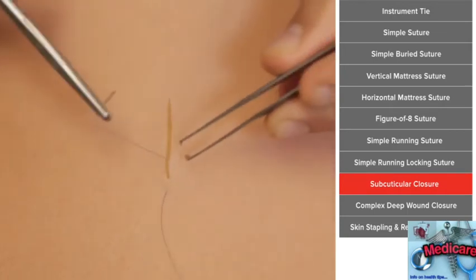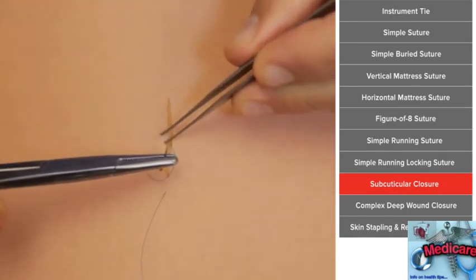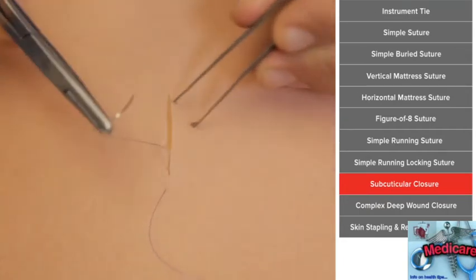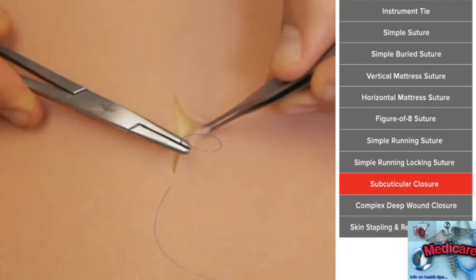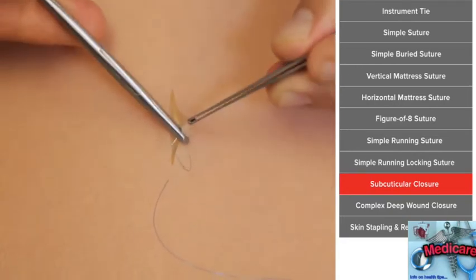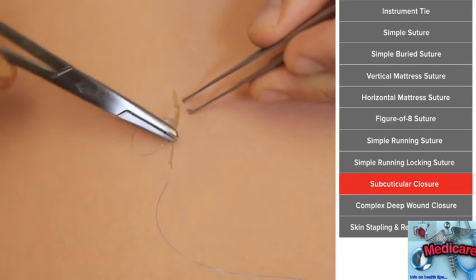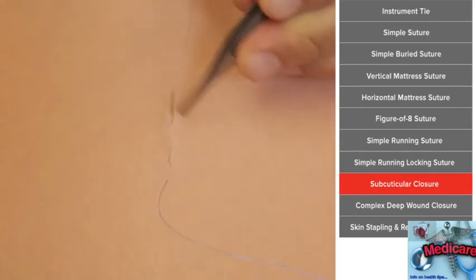So I'll enter from outside and enter just at the level of the deep dermis, and the key here now is to take horizontal bites in that deep dermis, exactly the same on both sides, and advance as you go. And what you see is I'm pulling the suture across to show where the next stitch should be, so I make sure there's no bunching.